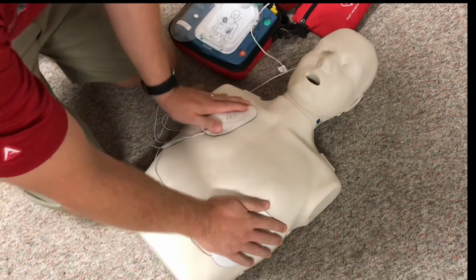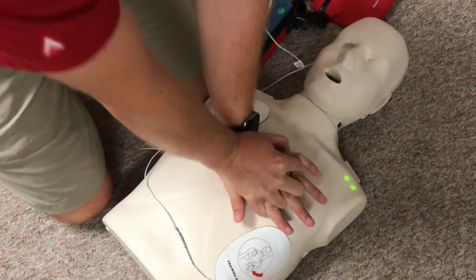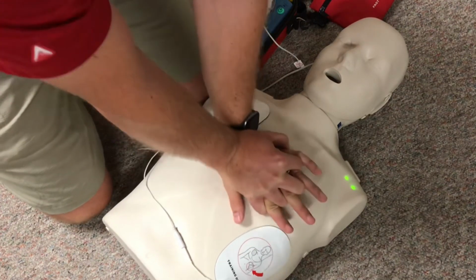Once analyzing, stay clear and do not touch the victim. When directed, press the shock button. Continue doing CPR and follow the AED's instructions until EMS arrives.